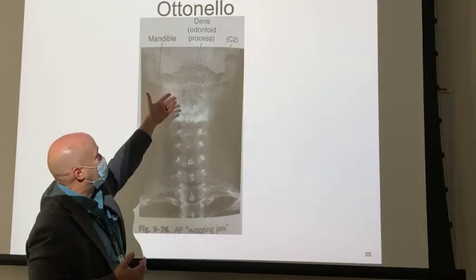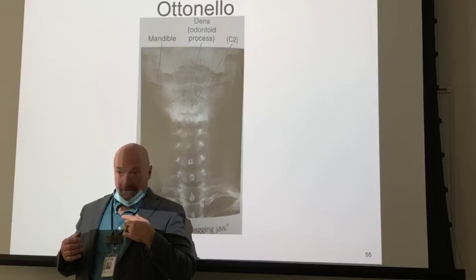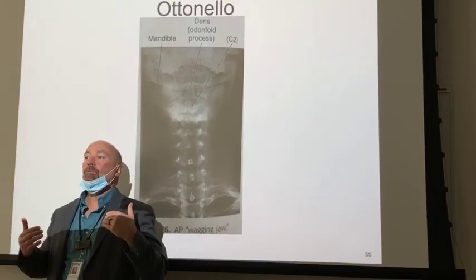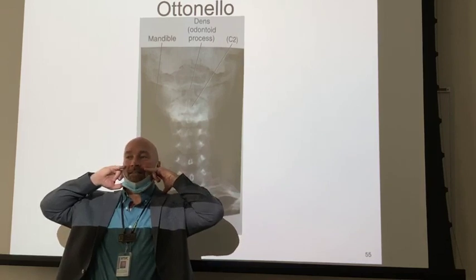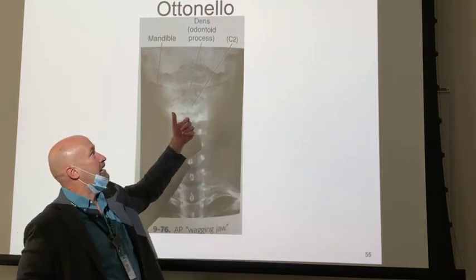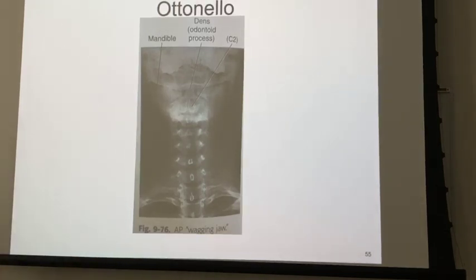Okay? So in a lot of cases, you'll take a look at this and say, well, patient would act like this, so I need to position them like that. No. If the base of the skull is here and the teeth are there, then it's just a subtle, his chin only needs to be tucked, probably in that case, 1/2 inch, right? So don't overdo it.